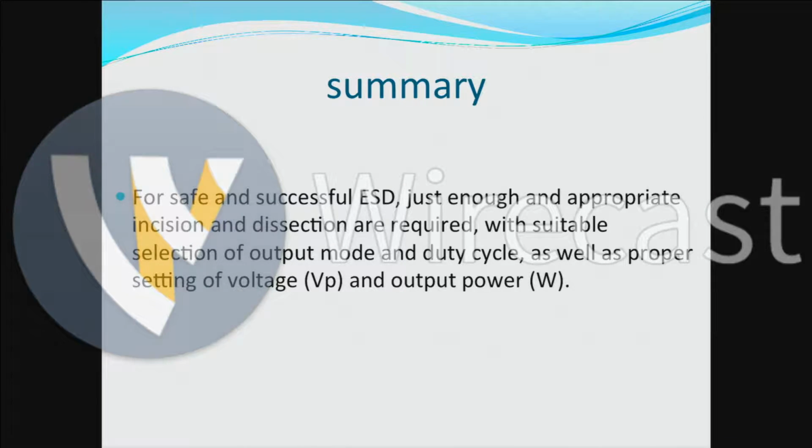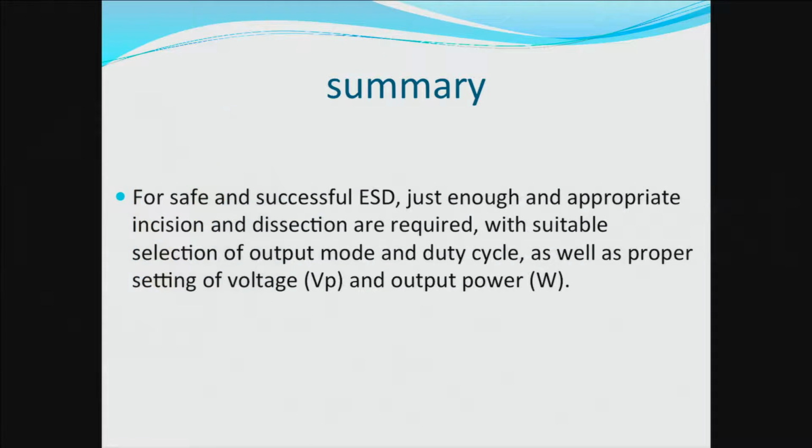If we must dissect some fibrotic tissue very quickly, we use an incision mode, and if there is no need for so hard a procedure with fibrosis, we change the mode from incision to coagulation, cutting mode.